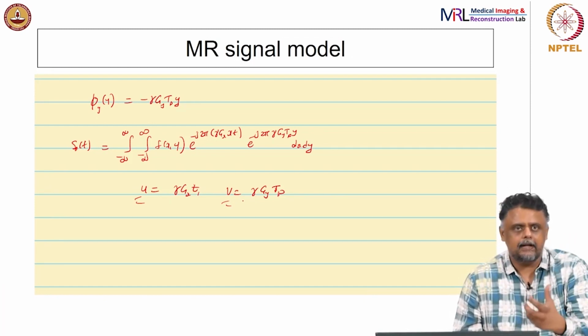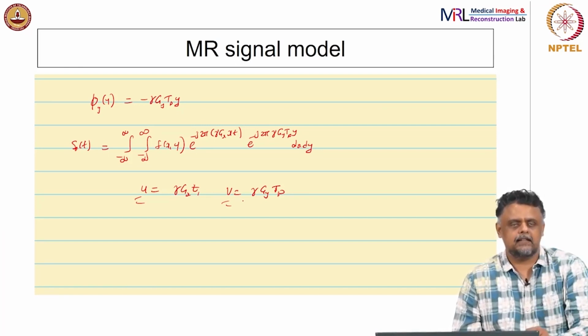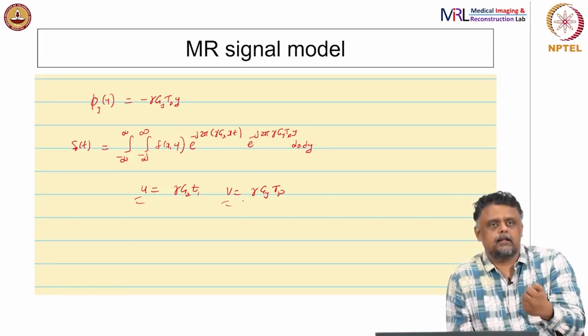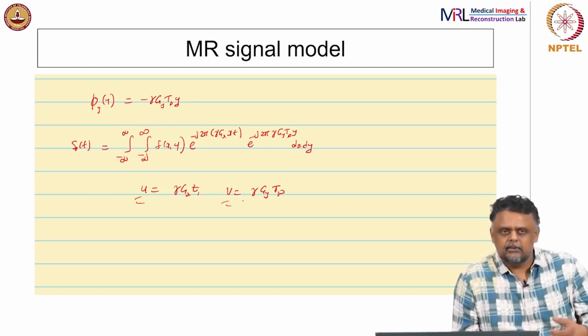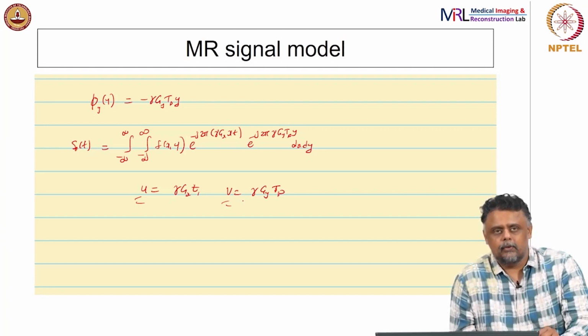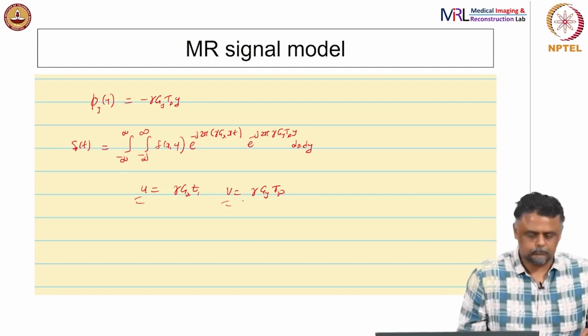In this case, you are looking at magnetization density as well as some relaxation time properties. So, this is more of a nuclear property that you are measuring. This is the property of the nucleus, specifically water. In CT you are actually measuring electronic properties. So, it is kind of similar, but kind of different that way. The sensing mechanisms of course are also different.